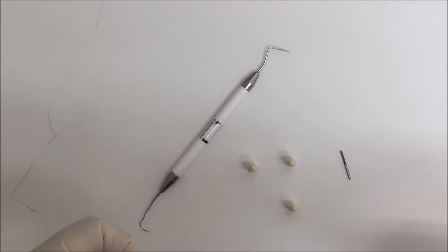Hello everyone, today I'm going to show you a video for the PFM (porcelain-fused metal), which is usually done on the upper canine for the ADC exam. Many candidates are having a problem with getting undercuts, especially labially on the canine.